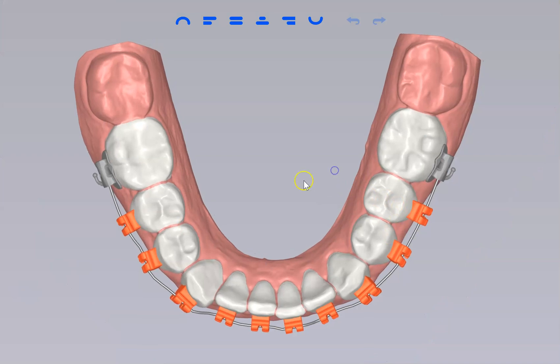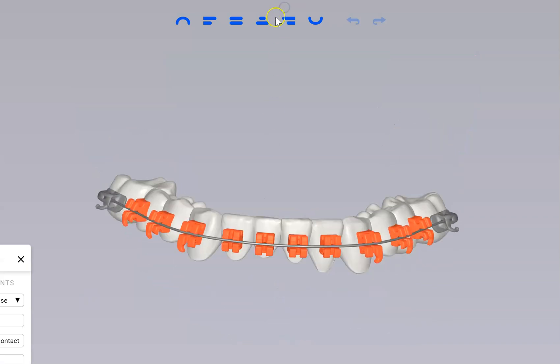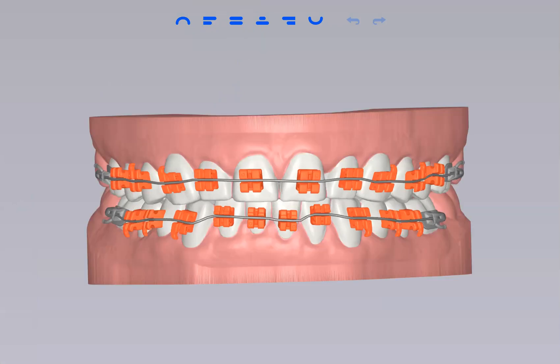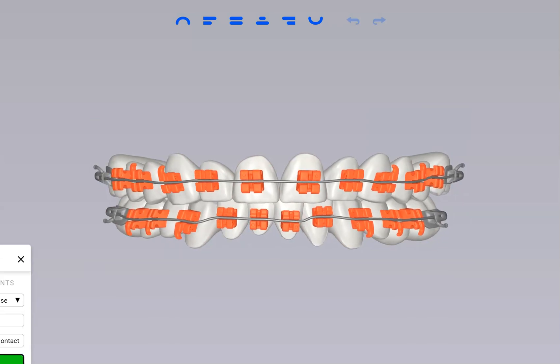Just wanted to show you a little bit about what that's going to look like. We're going to have to do a little reshaping in between these teeth to create the space that we're going to need. I think you're going to be pleased with the final result. This is what it looks like at the start, and this is the finish. And this is a little animation of how that's going to happen.